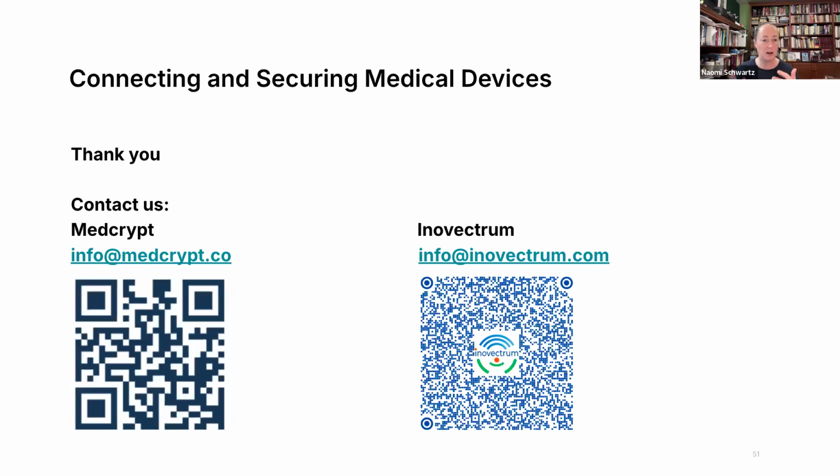So be very, very careful about being overt. We have a bunch of ports. They are locked down inside the system behind a case, behind locks, with special tamper-resistant screws and tamper-evident seals. All of those details show that you've thought about the risk and that you're doing something to protect from it. But if you fail to do that, FDA's reaction is usually, hey, there's a port. Tell me about it. Give me your risk analysis. Do your threat modeling. Tell me all these details.